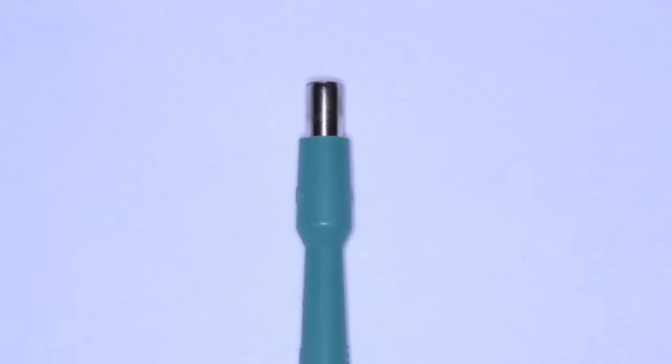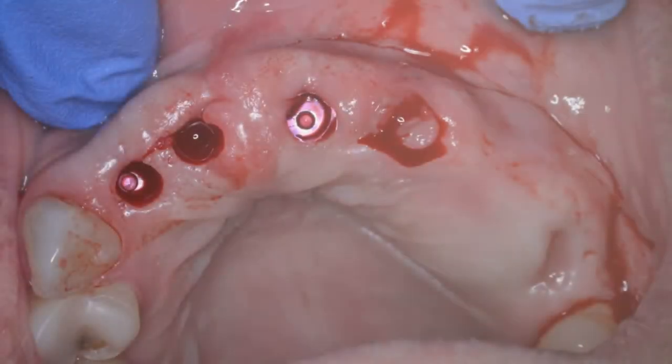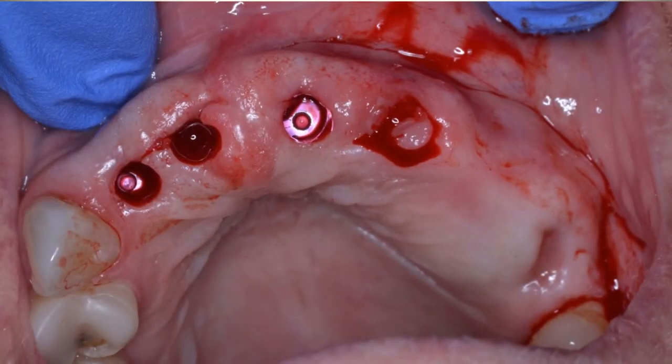And more or less, you have to have some sort of Jedi powers and know where those implants are. So you basically just punch in, you use an explorer or something to finish up that cut, and you can expose these implants. This is usually done in cases where you aren't going to benefit from that additional connective tissue or soft tissue around the implants. So if it's a case where you have minimal attached tissue or the tissue biotype is kind of thin, you may want to consider something like the H incision, which we're going to cover next.